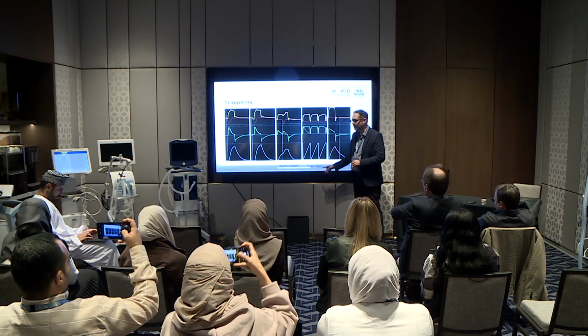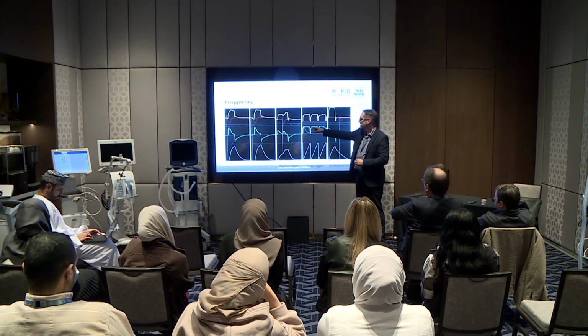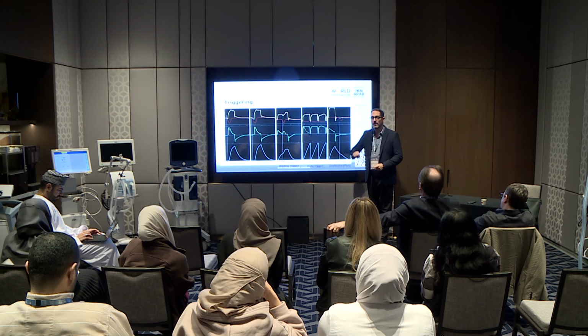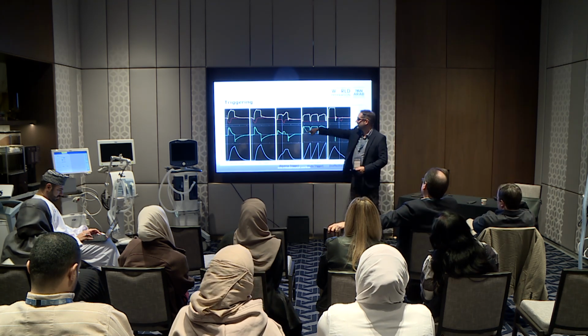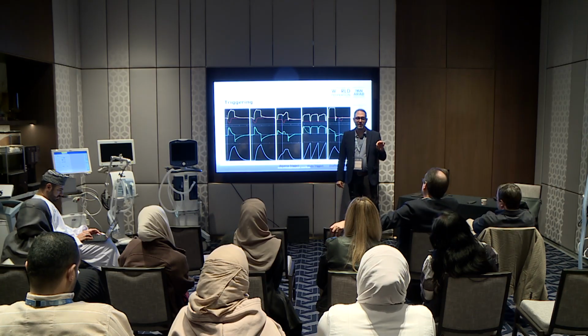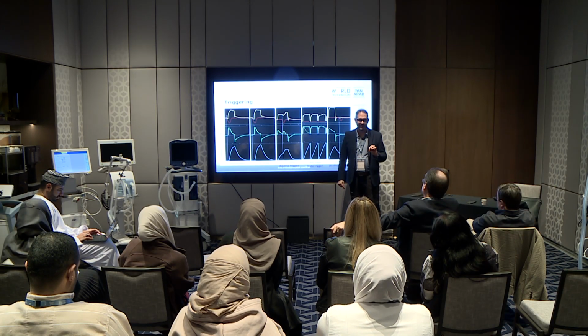This is false trigger or auto trigger. It means something is causing the ventilator to trigger. It could be a leak. It could be cardiac oscillations. Cardiac oscillations wouldn't do this. Cardiac oscillations look more like normal breathing. That's why it usually goes unrecognized.